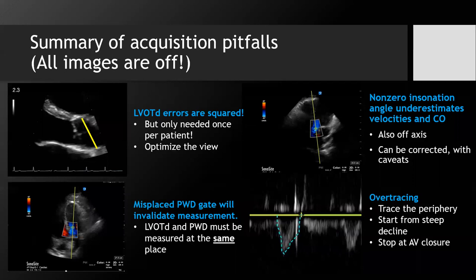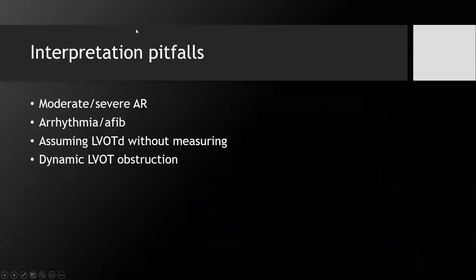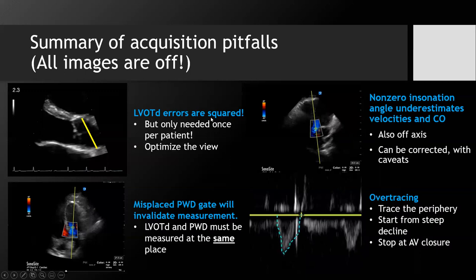So, summary of image acquisition pitfalls, I can share this with you later. This is just reiterating all the things that we just said. I made this just as a summary slide to have. So these are all image acquisition pitfalls. Now, some of the interpretation pitfalls.